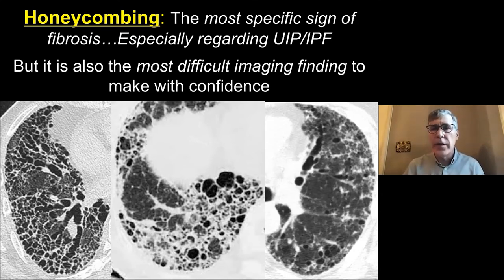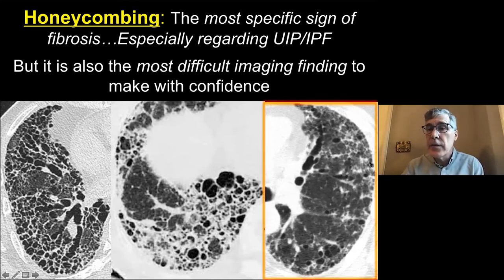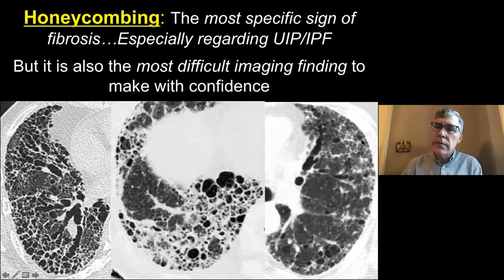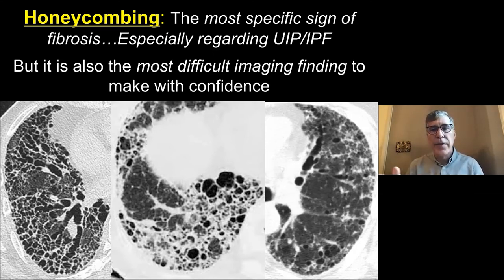So look carefully: are the cysts right up against the pleura? Yes — they're heaped up, there's traction bronchiectasis, irregular visceral pleura, peripheral distribution — that's UIP with honeycombing. This next one gets more difficult. Is this honeycombing? I think it is — I'm moderately sure. But it's tough, and if I'm not sure, I'm probably not going to come down totally on UIP, although you can tell by the distribution.